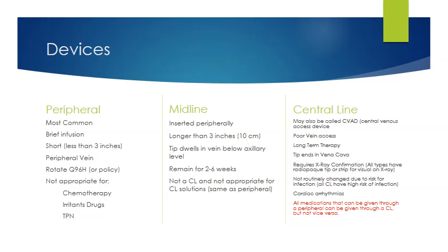considered an irritant drug. When you look at the midline, they are actually inserted peripherally, but they are inserted by sterile technique. We know whenever we just start an IV in someone's forearm, it's not a sterile technique. Remember, it's clean technique, or asepsis, as clean as we can possibly get it. The midline is a sterile insertion. It's inserted peripherally in the upper forearm usually. I believe that they usually try to use the basilic if at all possible.